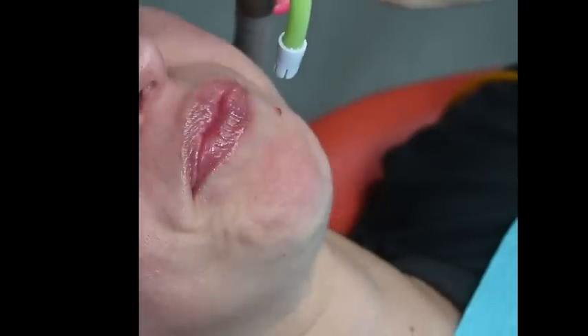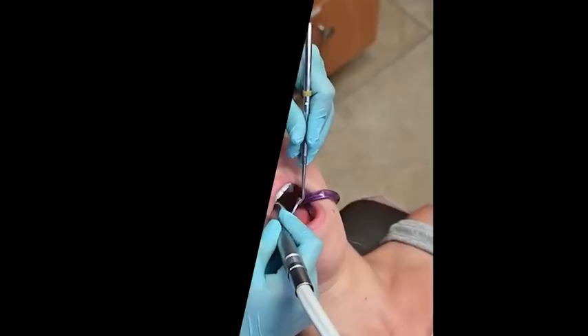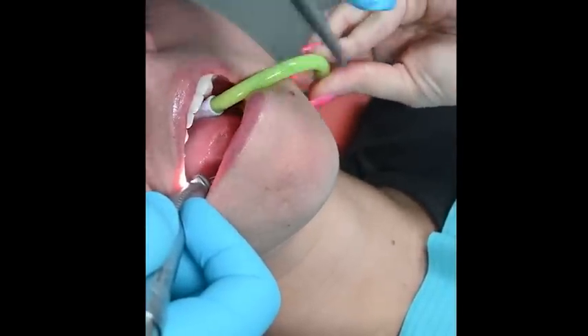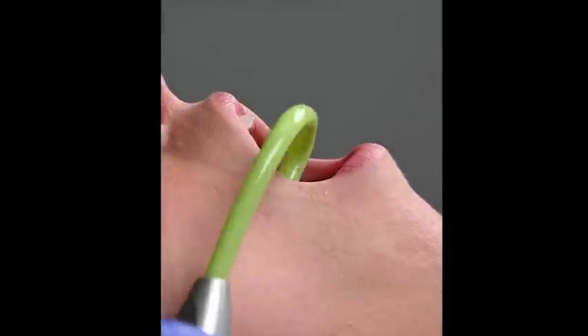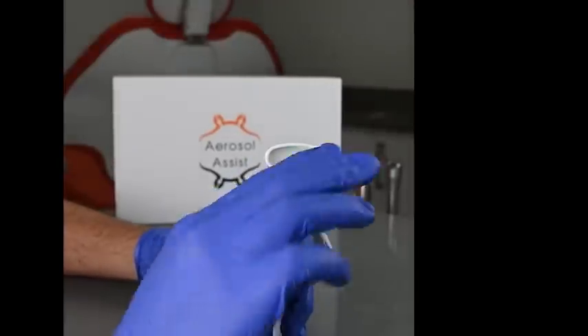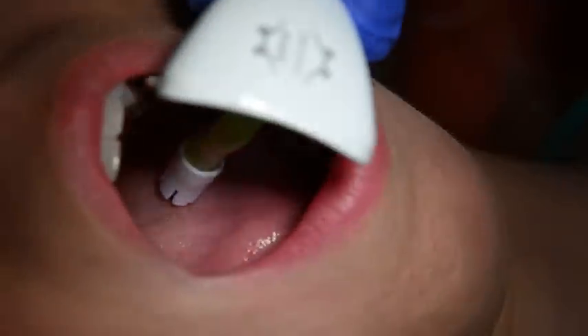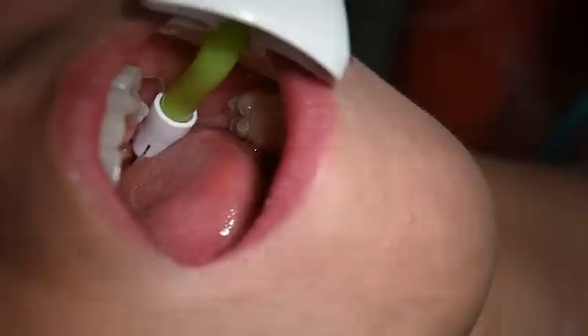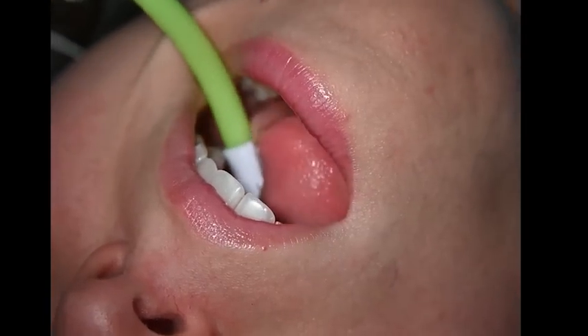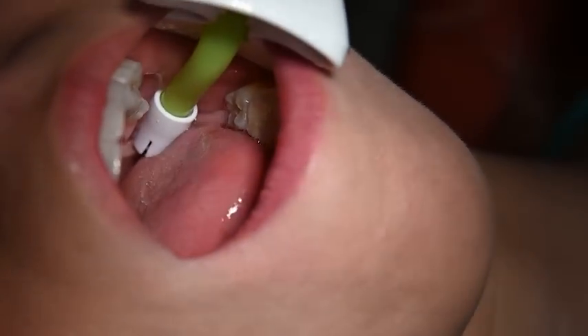The saliva ejector — from falling off, being picked up by patients due to it being uncomfortable, or by just doing its own thing after you find the optimal position — it is long overdue for an upgrade. The aerosol assist is designed to upgrade the functionality of a standard disposable saliva ejector so that it can be truly customizable, comfortable, and easy to use. The saliva ejector is one of the most used tools in dentistry, so why not make it as efficient as possible?